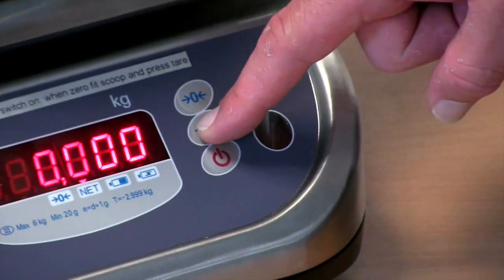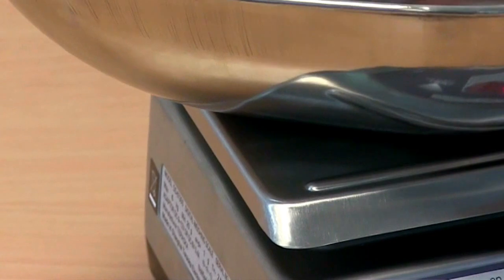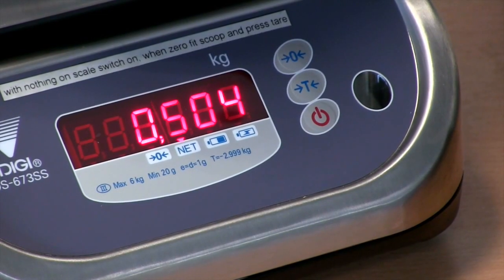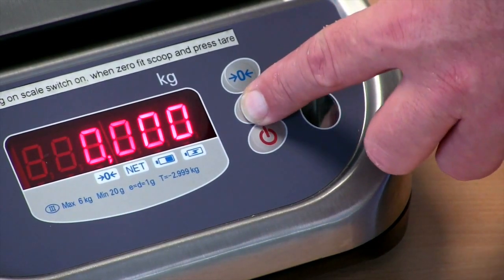Add the bowl, box or tray to the scale, press tare and then add the item or items back into the bowl and place them on the scale. As you can see the scale gives an accurate reading of the items without the weight of the bowl included. To remove the tare value after weighing, press the tare button again.